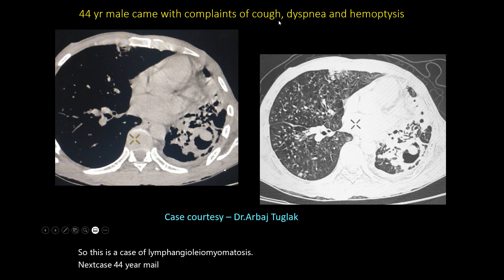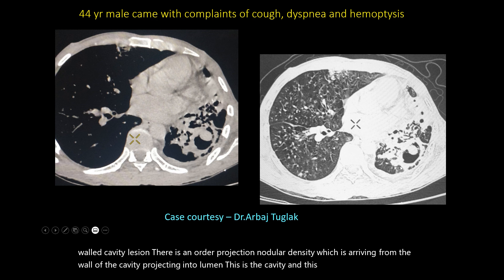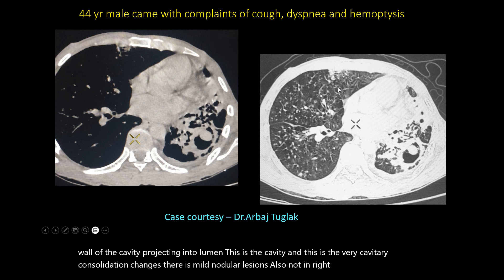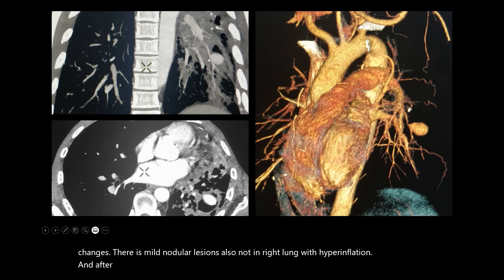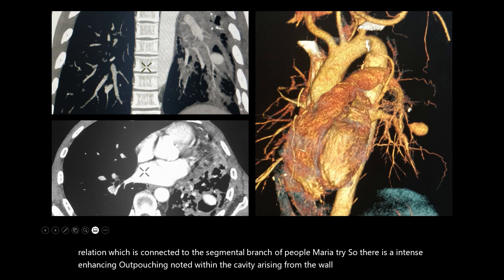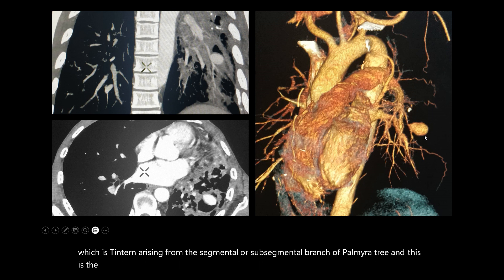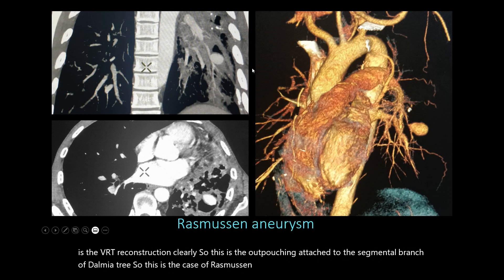Next case: A 44-year-old male presenting with cough, dyspnea, and hemoptysis. There is a thick-walled cavitatory lesion with a nodular density arising from the wall of the cavity, projecting into the lumen. This is the cavity with pericavitatory consolidation changes. After giving contrast, there is intense enhancement noted within the nodular lesion, which is connected to the segmental branch of the pulmonary artery. The VRT reconstruction clearly shows this outpouching attached to the segmental branch of the pulmonary artery. This is a case of Rasmussen's aneurysm arising from a pre-existing tubercular cavity.